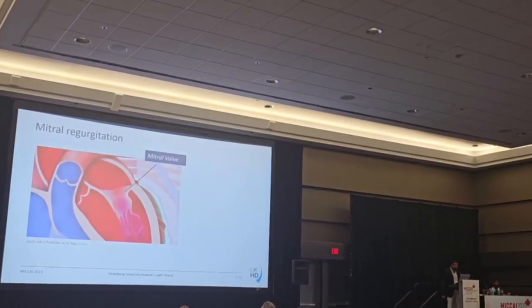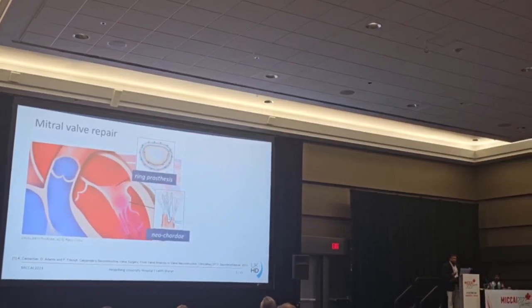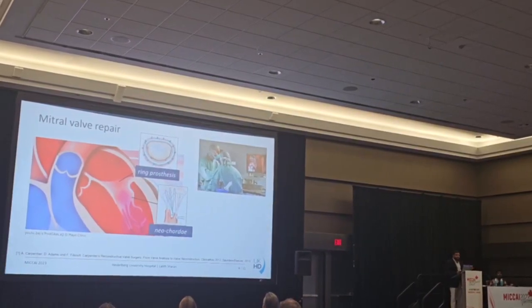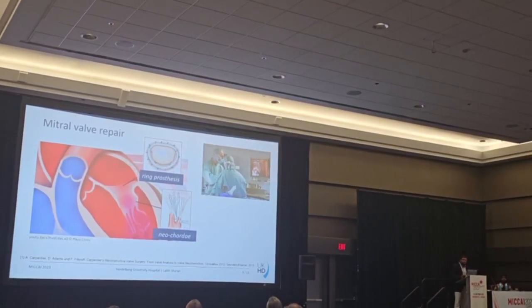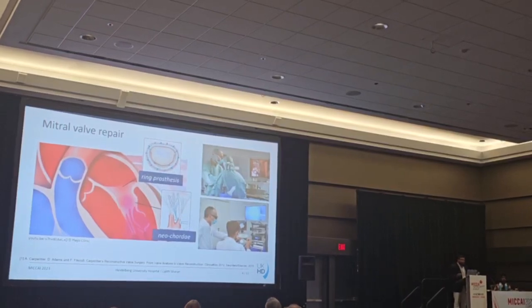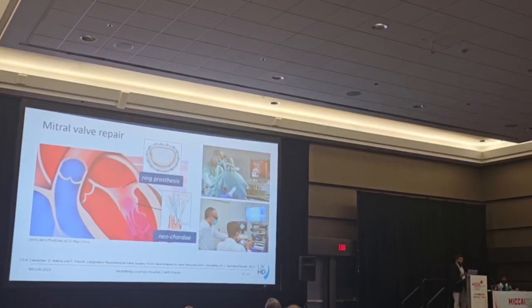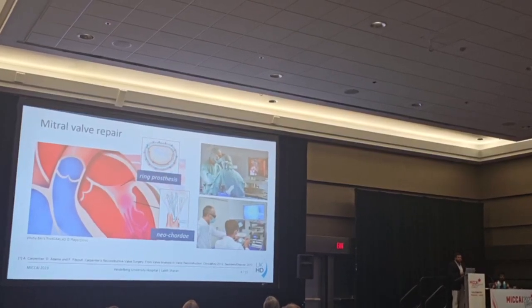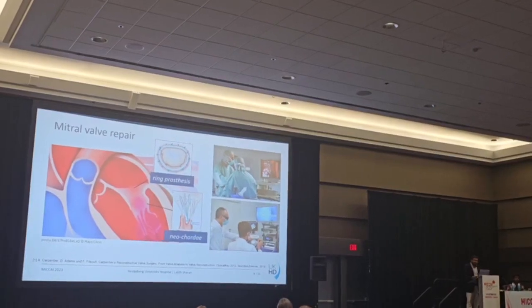And the gold standard to treat this is by implanting a ring on the valve and attaching an artificial chordae. And this is typically done in a minimally invasive manner using endoscopic support. And this is an extremely challenging and expert-driven surgery. And the surgeons sometimes also use a patient-specific simulator that you can see here for surgical training and planning. The work of my thesis focuses on using the endoscopic images that we get from these two domains to support this surgery. And I'm going to tell you how.